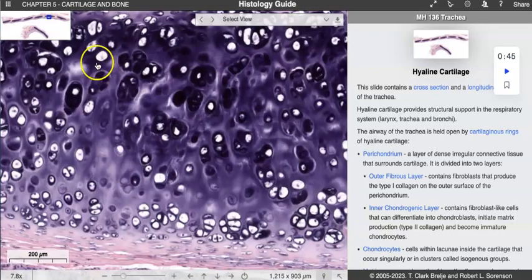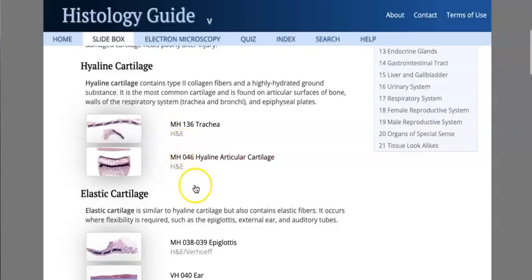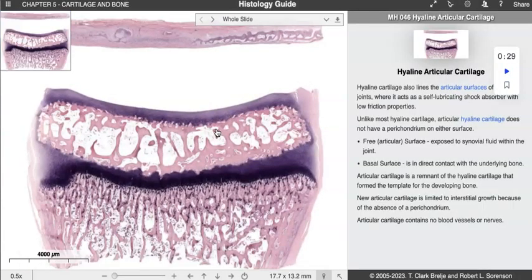So one thing that we can do, let me give you this a pause. I'm going to head back over, well, maybe I don't have to pause. Let's see how fast we go. So if we go over to articular cartilage, and I have also a video for bone development as well, we can go to that articular cartilage here. And so you have a slide box, and your slide says the fetal pig joint area. That whole epiphysis is still hyaline cartilage, so that would be another area you could go to. You could go to your epiphyseal growth plate slide, and it would have both primary and secondary ossification. So this bone is basically kind of like in development.